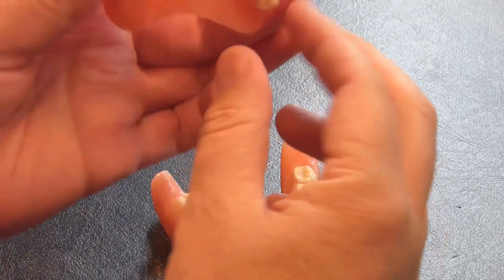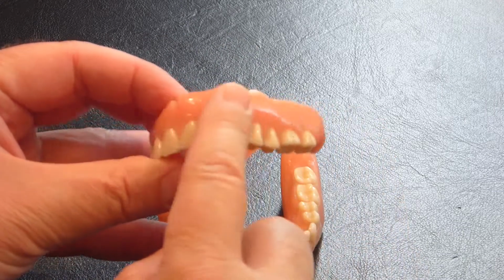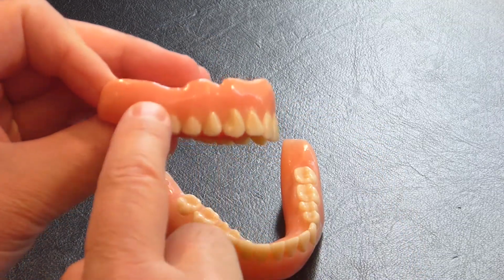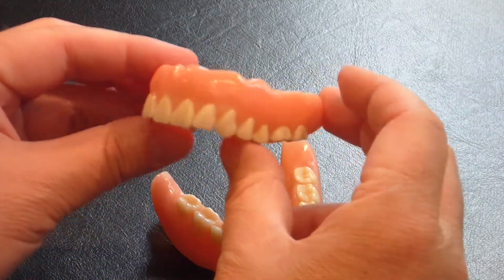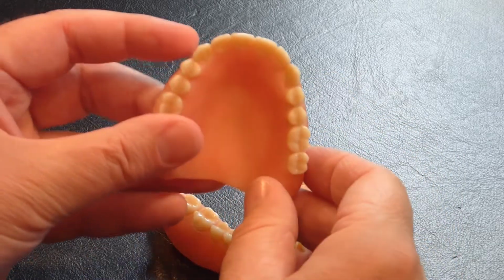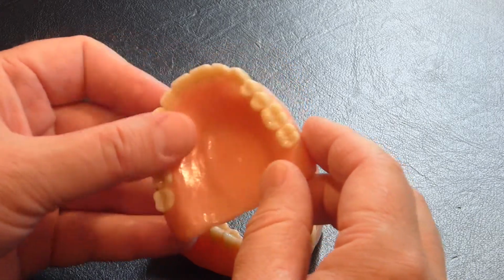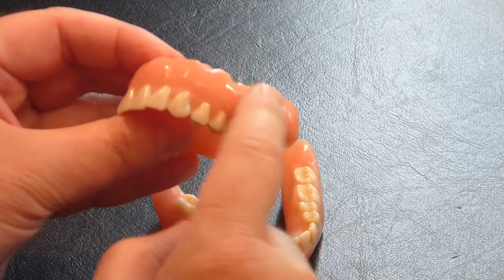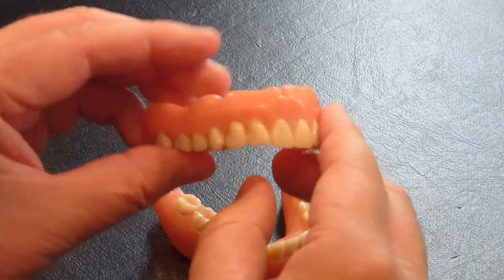The dentures themselves are made out of a pink acrylic, denture acrylic. So it's pink colored, it's got some little flecks of red to give it a little bit more lifelike appearance. And then the teeth themselves are made out of acrylic as well, so that way you have a nice strong chemical bond between the tooth and the plastic of the denture. It helps keep them from breaking off.